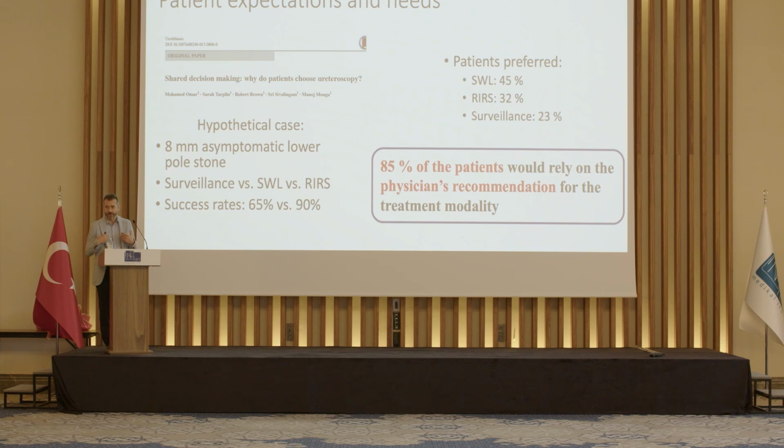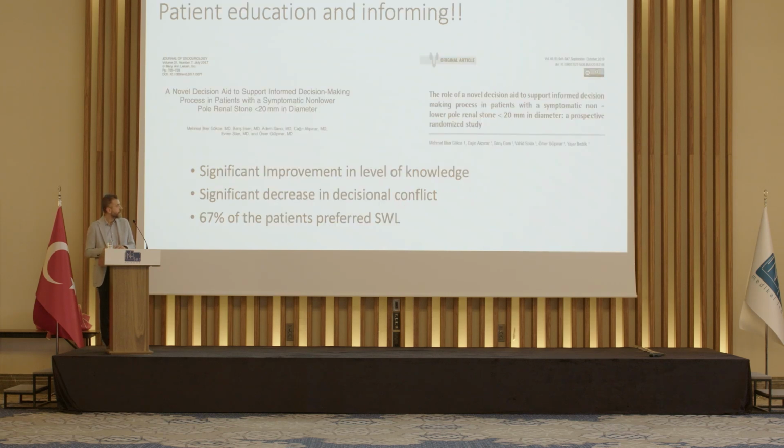So our opinion as the physician is more important, because especially in Turkey, in our country, the patients usually say, okay, doc, you can do whatever you like. Which is the most successful in your hands, just do it. So it's really important that we need to have everything in our hands and select according to the patient characteristics. And to get a better patient perception of the procedure, we need to educate our patients well.